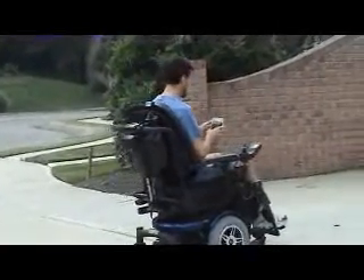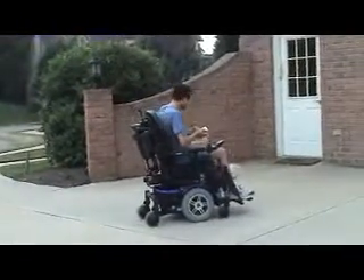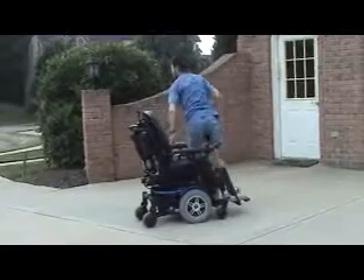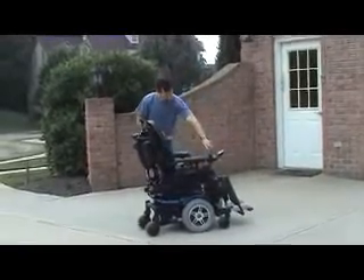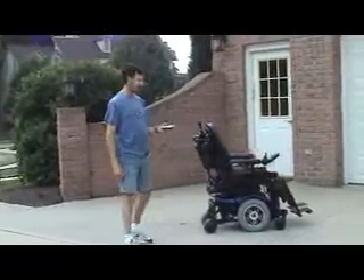The cool thing is, it's totally wireless, so I'll stop for a second. Get off. Start her up again. And now I can control it from alongside.